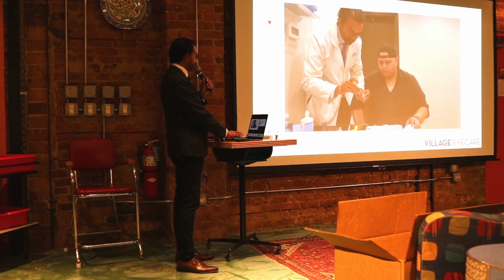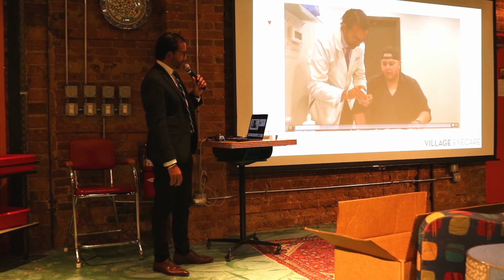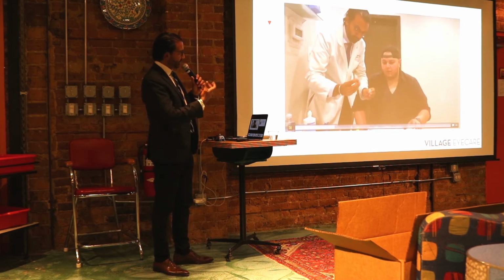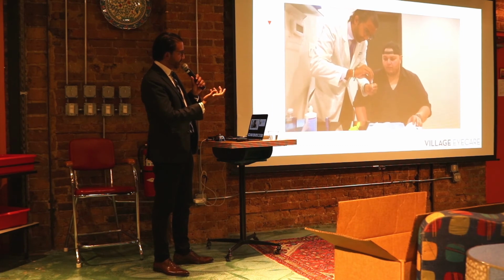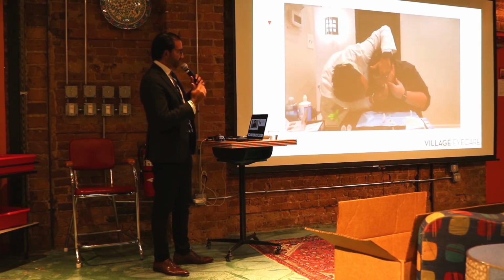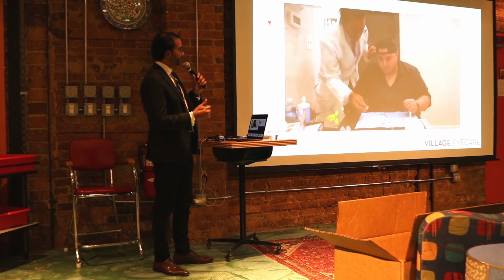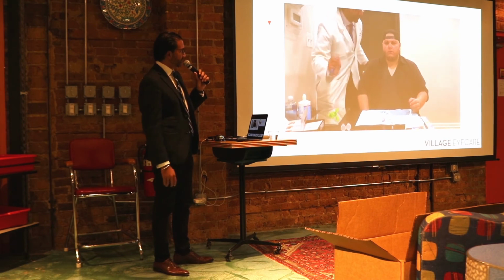The very first time the scleral lens goes on a patient's eye, I prefer to be the one that's doing it. And the reason being is these are not easy lenses to get on. So I'll fill the lens with saline. I like to use the DMV inserter. The reason I like to put it on is I want to give the patient confidence that it can be done and it's not a struggle. If it becomes difficult up front, you don't want to plant that seed of doubt.